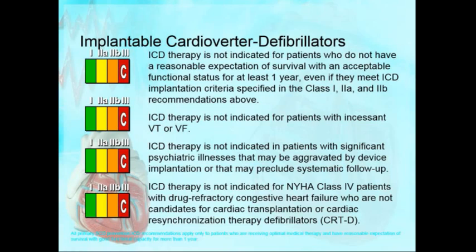The controversy is this though. ICD, you can turn it off, no big deal. However, if somebody says, take off my pacemaker function, and is pacemaker dependent. That is a catch. If somebody has heart block, complete heart block, he got a pacemaker put in 10 years back. Now he's 95 years old, metastatic bone cancer, hospice. He says, turn off my pacemaker.